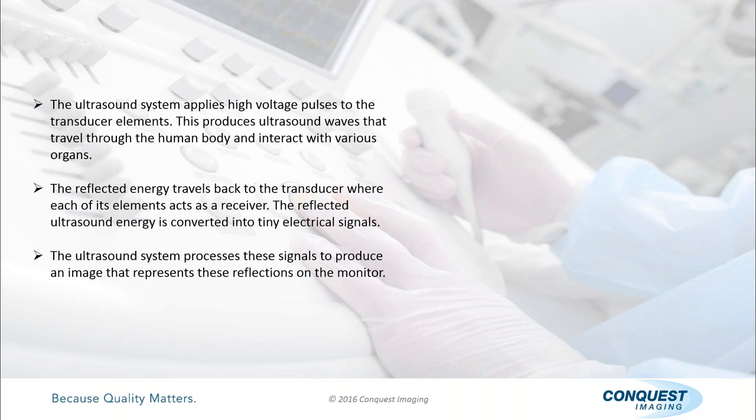It would be a much better process to turn the phantom, the Model 539 Phantom, on its side and image these contrast markers where there is no interference with a different density of materials. So I just like to point that out.